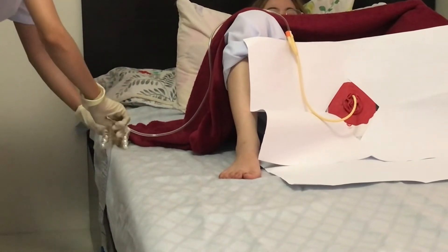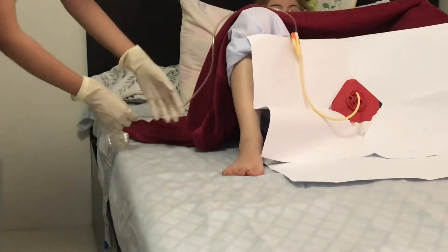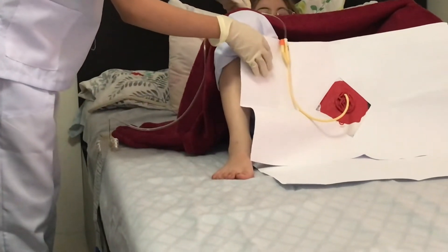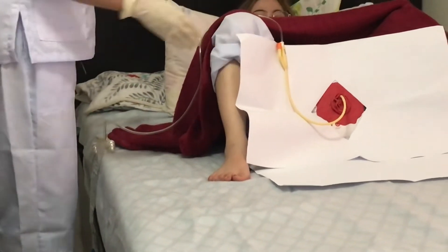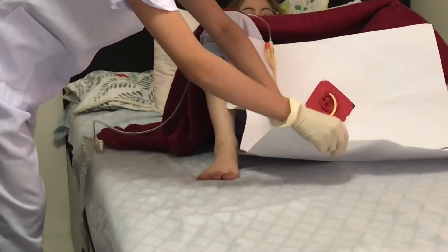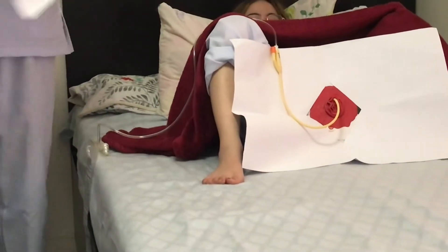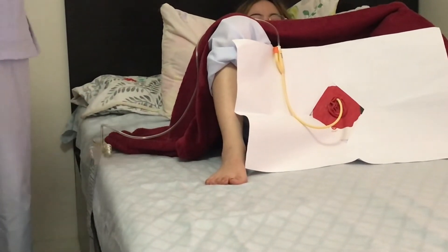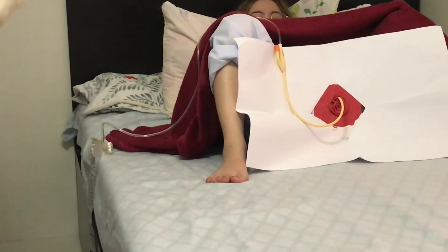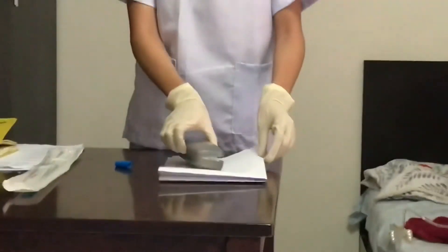Ensure the tubing is not kinked and secure the drainage bag to the bed frame below. Dispose of used supplies. Place the syringe in the sharps container. And then remove the gloves. Assist the patient to a comfortable position.